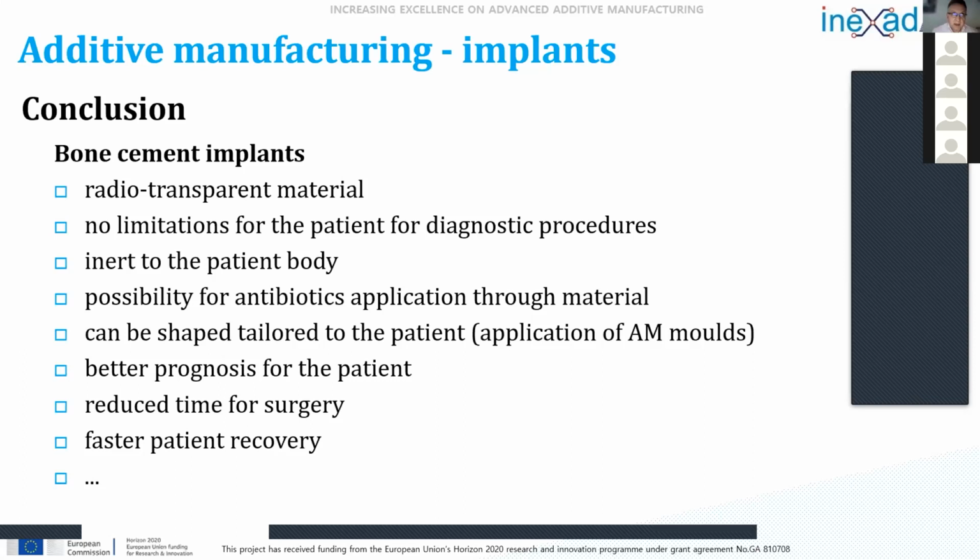We had some nasty cases in the past with titanium implants, where the process of selective laser melting was not guided at higher quality. After production of the implant, some titanium particles remained unsintered, and after a certain time those particles caused problems for the patients.